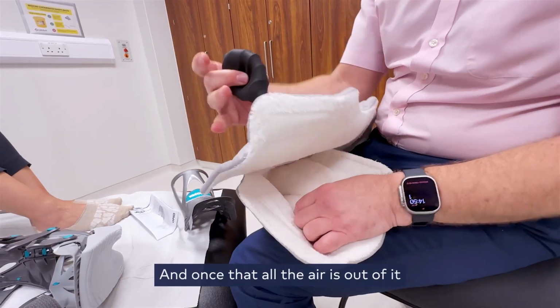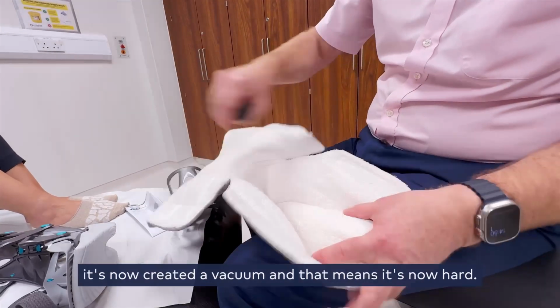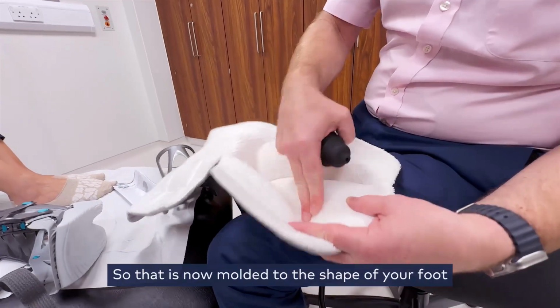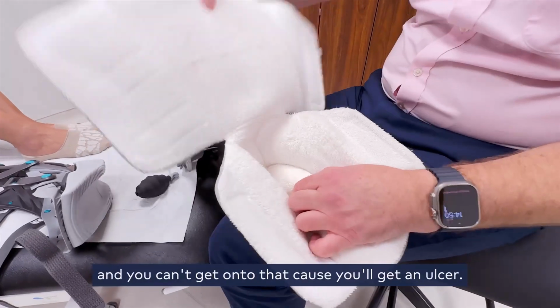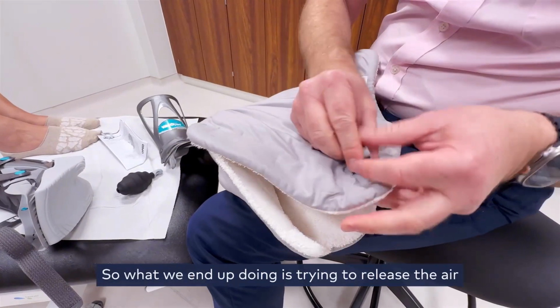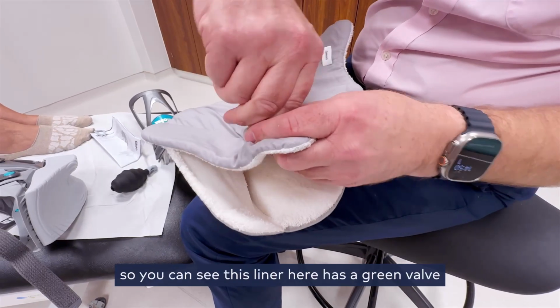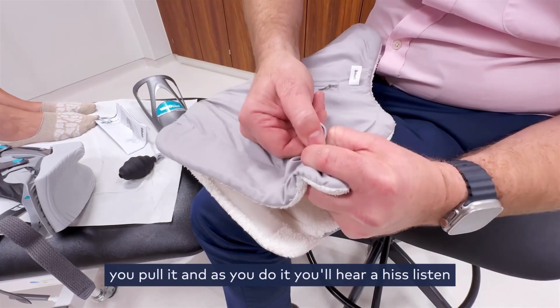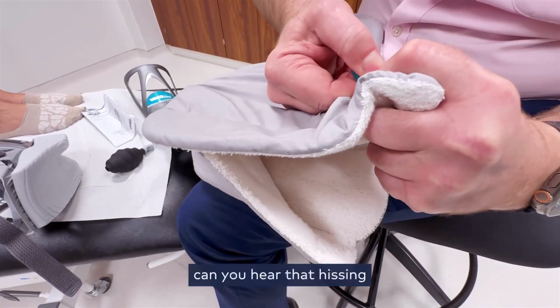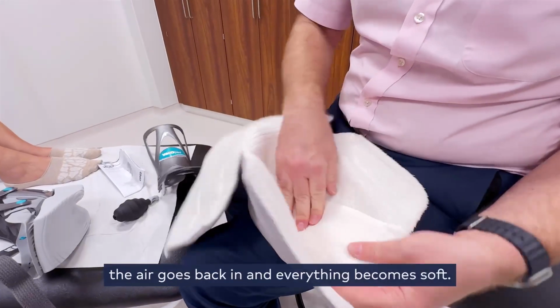Once all the air's out of it, it's created a vacuum, and that means it's now hard. So that is now molded to the shape of your foot, and it's rock hard. You can't stay on that because you'll get an ulcer. So what we end up doing is releasing the air. You can see this liner here has a green valve, and you pull it, grabbing the plastic, and as you do it, you'll hear a hiss. Listen. Can you hear that hissing? That just releases everything. The air goes back in and everything becomes soft.